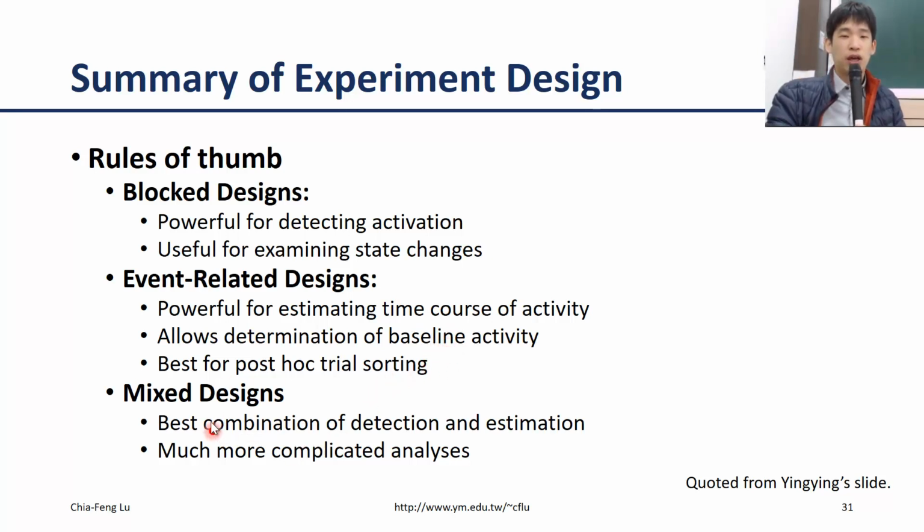Okay. However, there is a final one I didn't mention in this course, but if you'd like to read more, you can find some materials online. There is a mixed design. Definitely it can combine the pros from different designs, but of course, not only will the presentation be delivered in a very complicated way, the analysis will also become very complicated because it combines these two different designs.